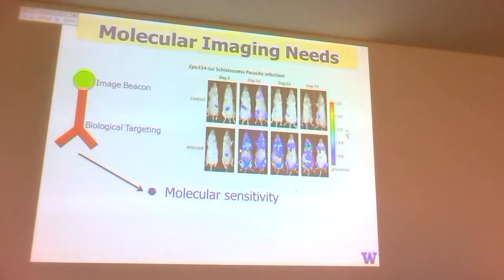Consider the molecular image as if I went 3 centimeters into the body. I was able to take a microbiopsy of 1 nanoliter of tissue. I could bring it out. I can then put it in an assay with targeting agents and measure however I do that. And I can do single molecule counting of the biomarkers within that 1 nanoliter of tissue. Okay? So if you could do that non-invasively, that's sort of like the ultimate goal of molecular imaging. Well, first of all, you have the sensitivity, right? Can you count individual molecules when you are well down into the body?